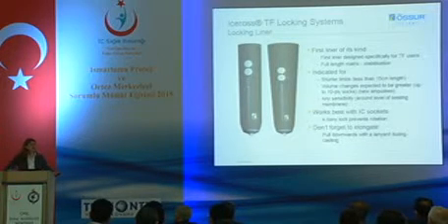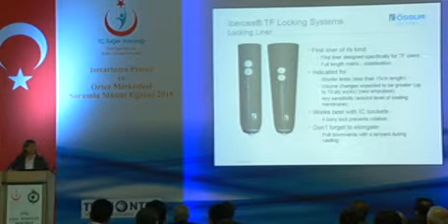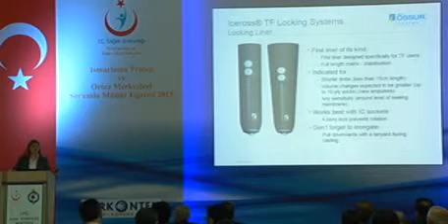One thing that most people forget to do though when casting is to elongate. So we should always pull down with a lanyard during casting to make sure that we stabilize those soft tissues.